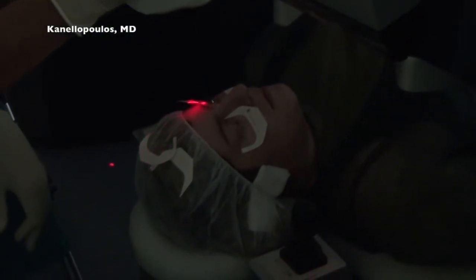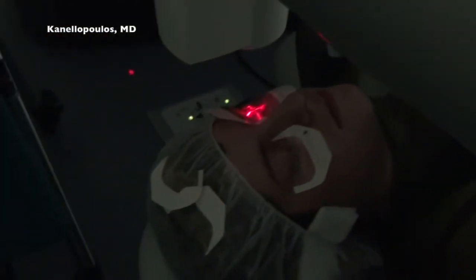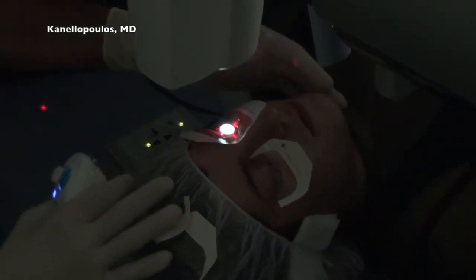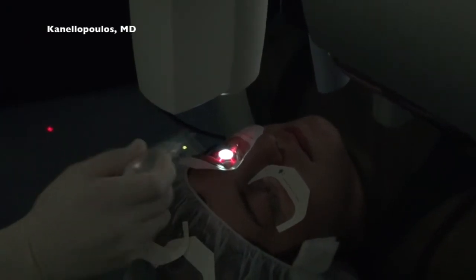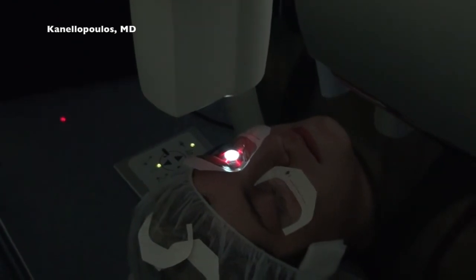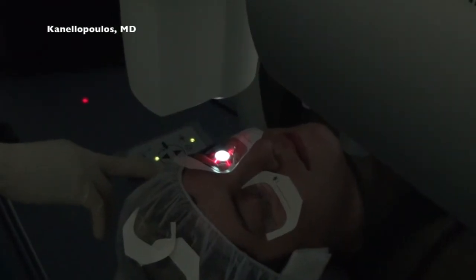And we're finishing here the case with the KXL1 device mentioned before, 30 milliwatts per centimeter square fluence for just 60 seconds. This delivers under 2 joules of total energy. The device has a joystick that can help us center it on the patient's cornea, and the red crosshairs center the UV beam on the z-axis. We can see here a close-up, very magnificent filming by our friend Paolo. Grazie Paolo. And treatment with the UV device is over.